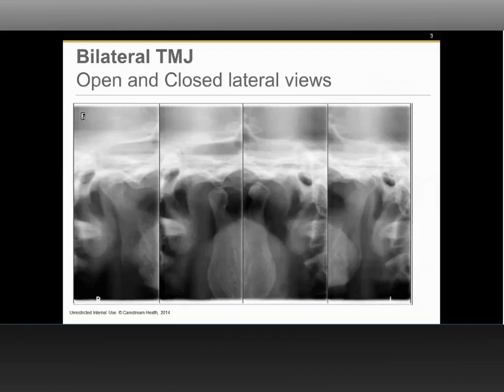Jordan, I think you just brought up a very good point. The reason 2D imaging is more prevalent among the dental community is simply because it is more available to the dental community as opposed to three-dimensional imaging. But that has changed. 3D imaging provides much more detail in terms of analyzing the anatomy of the TMJ. So there is a small shift, or a big shift, in fact, that's happening towards moving from two-dimensional to three-dimensional imaging of the TMJ. So you're emphasizing that it's the third dimension that's critical, and that's what's missing from the 2D radiographs. I think you have nailed the point.